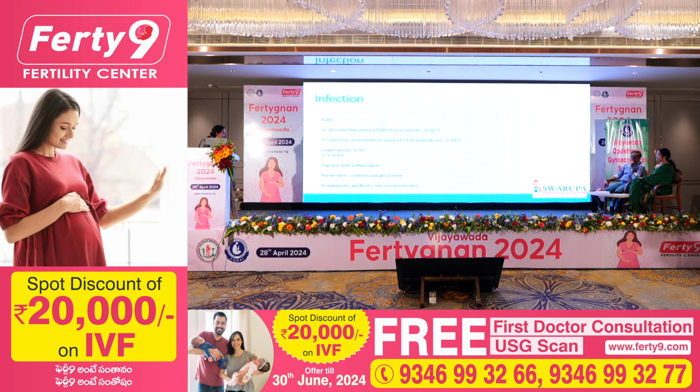Actually, prophylactic antibiotics are also not recommended while doing a hysteroscopy. A prospective observational study has shown that it is just 1.4%. Endometritis is around 0.9% and UTI is around 0.6%.